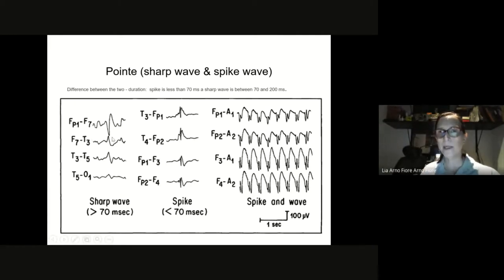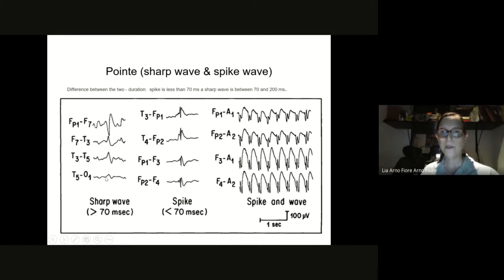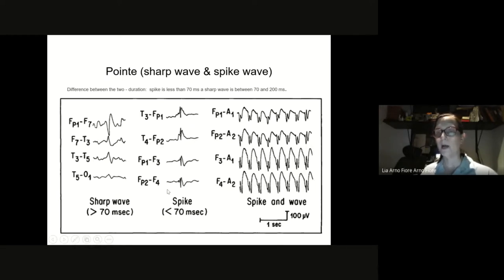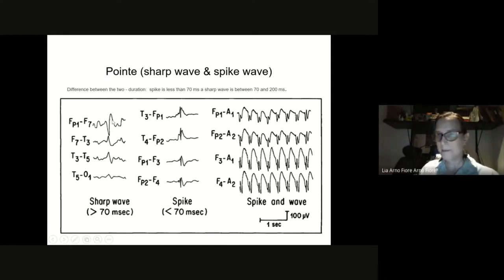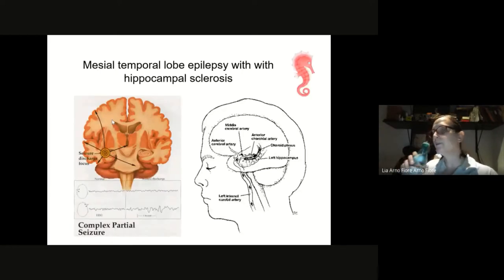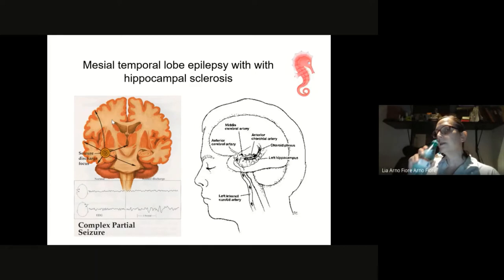Epileptiform modifications you need to remember: the sharp wave and the spike. The French call this 'pointe,' but you can divide them into sharp waves — more than 70 milliseconds — and spikes, which are much spikier. Of course you're not going to start measuring every time; just by looking at it you can see the pattern — this one is thin and this one is a little more open. Then you have complexes like spike-and-wave. Let's start with the most common in adults: mesial temporal lobe epilepsy with hippocampal sclerosis.